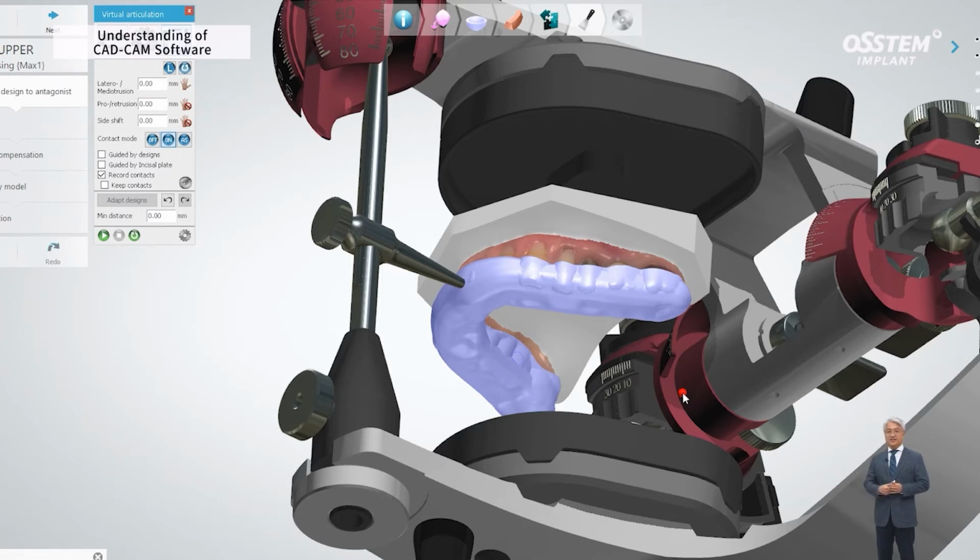By using this CRS, if you print it out using a 3D printer or a milling machine, you'll be able to provide a more accurate prosthesis and reduce the amount of time required for occlusal adjustment. Because you're providing a prosthesis that has gone through simulation, the precision goes up. If you set it, it fits well. It's more convenient for the patients.